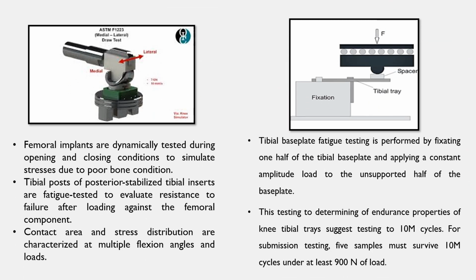This is an example of total knee replacement testing. Femoral implants are dynamically tested during opening and closing conditions to simulate stresses due to poor bone condition. This is called fatigue testing. This testing is to evaluate the resistance to failure after loading against the femoral component. The contact area and stress distribution are characterized at multiple flexion angles and loads.